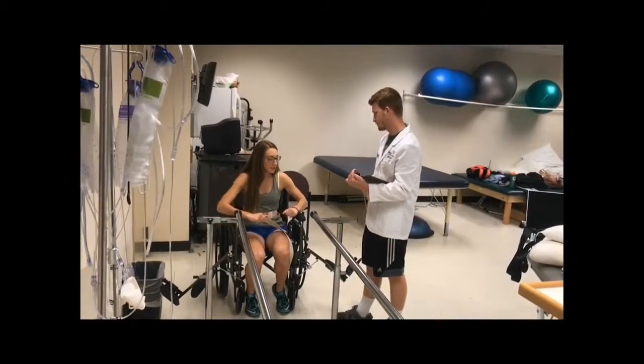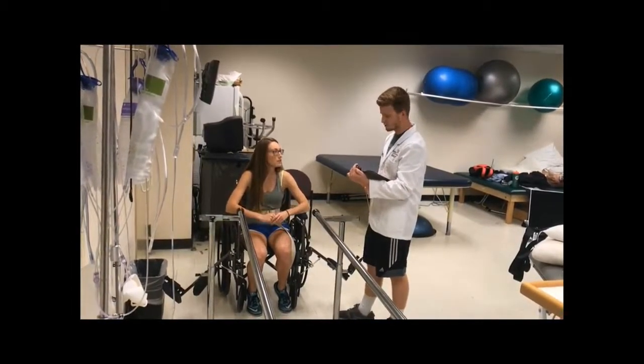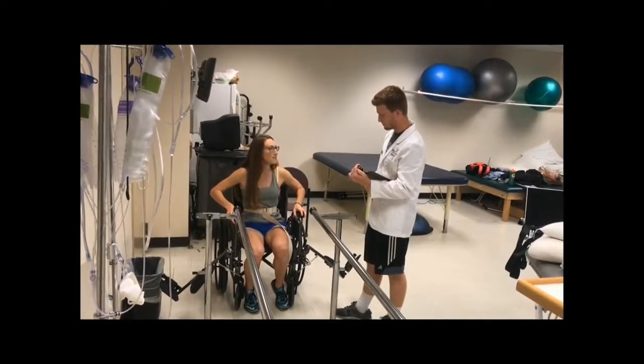So what are we going to be doing today? We're standing up to the parallel bars. Yes, we are. And what are you going to push up on? The armrest. Yep.